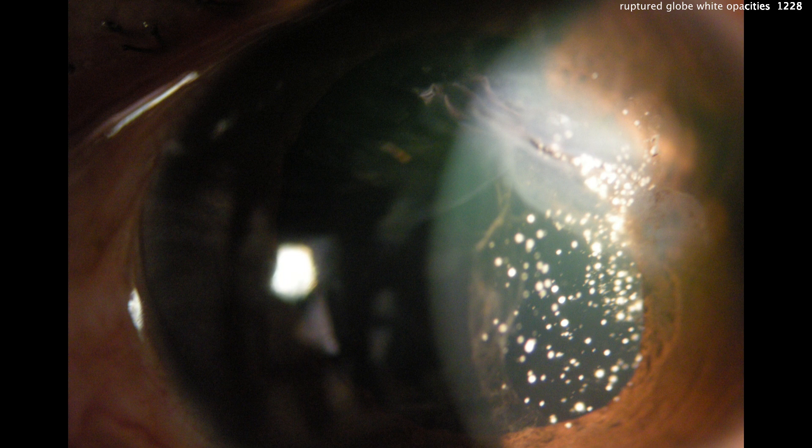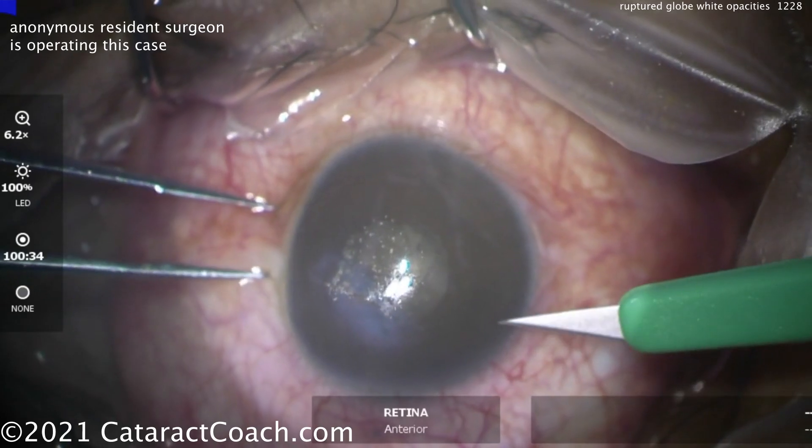That, viewers of Cataract Coach, is vitreous. The patient has asteroid hyalosis. You can see this injury is so severe that vitreous is coming from behind the iris, up into the anterior chamber, and out of that corneal laceration. Yes, that is vitreous.